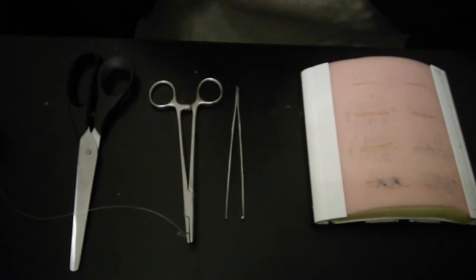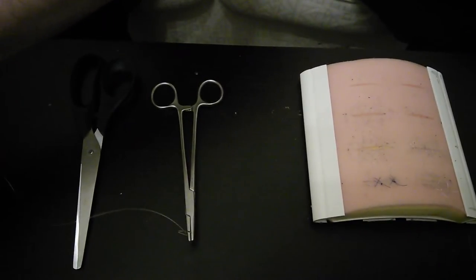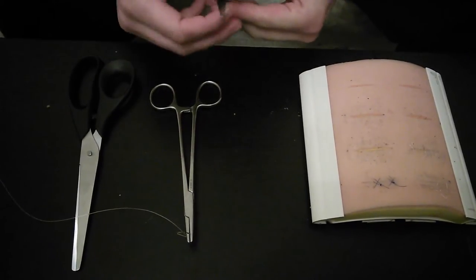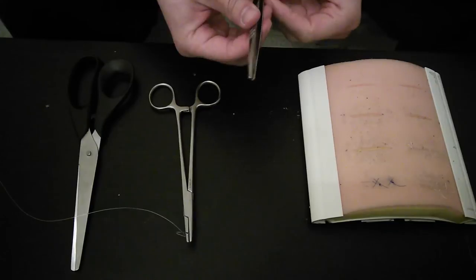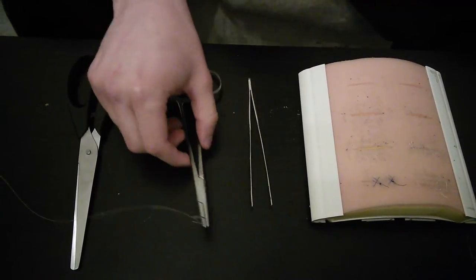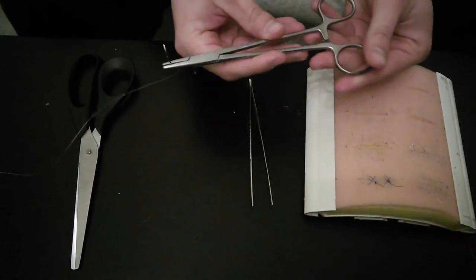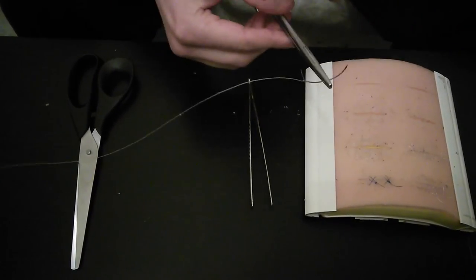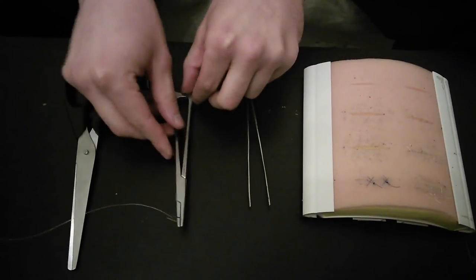You will need a pair of serrated forceps and tweezers, Myohager needle holders with a needle and thread, and scissors.